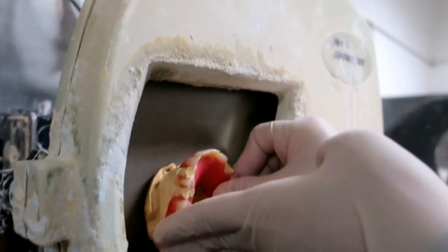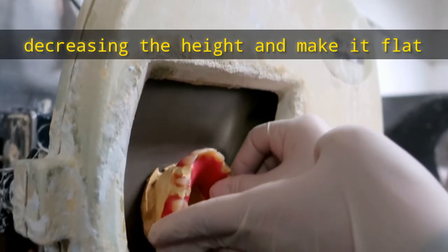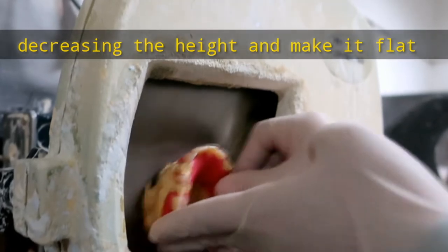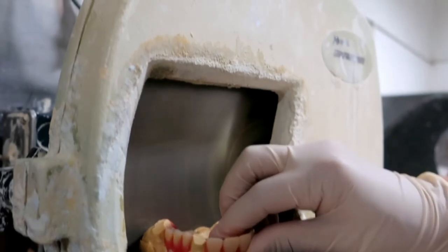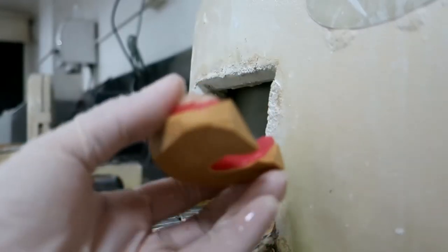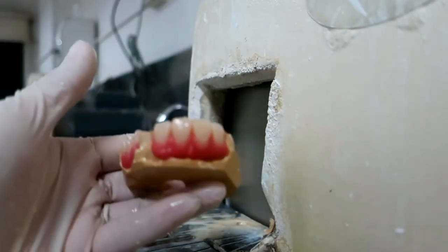I always trim first from the back and make the cast sit up to see that it is perpendicular to the plane of occlusion. It is important to make it flat. This is how it looks when it's finished for trimming.